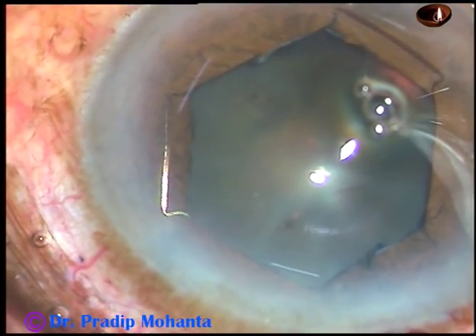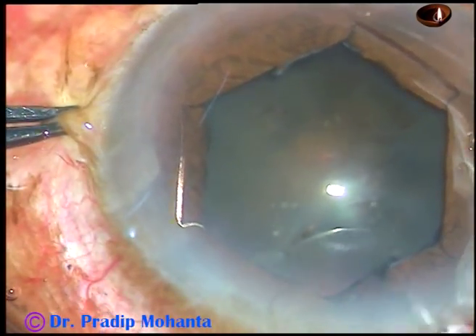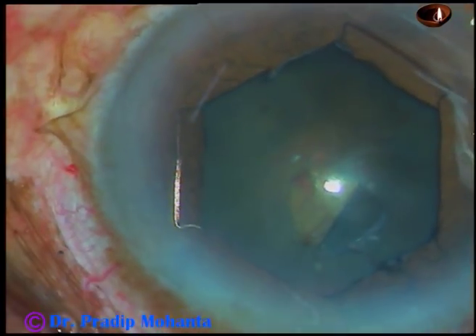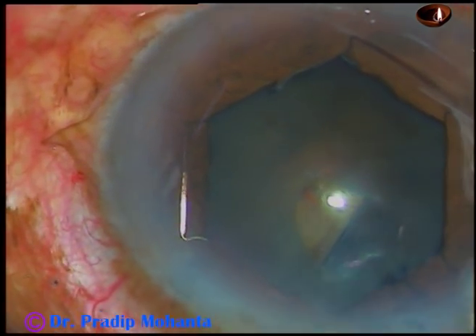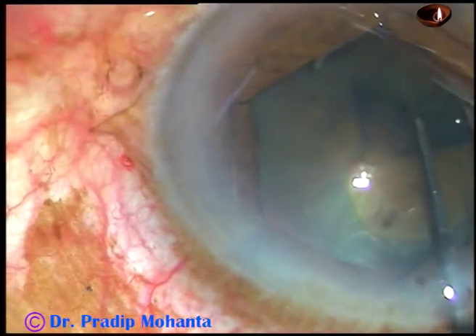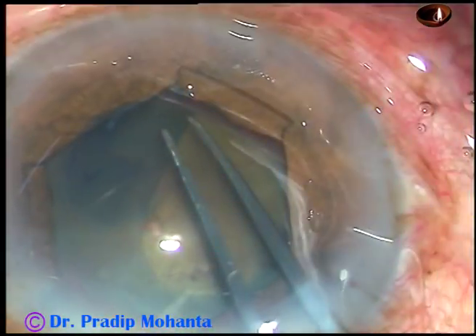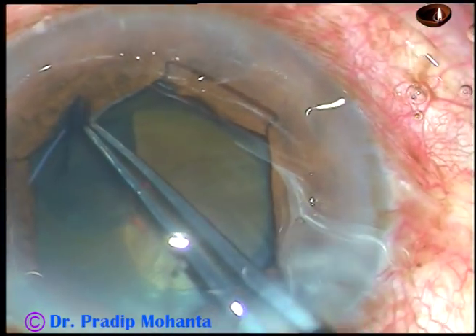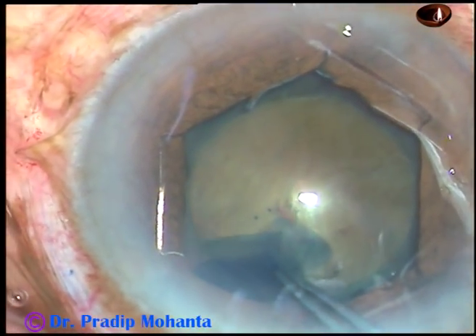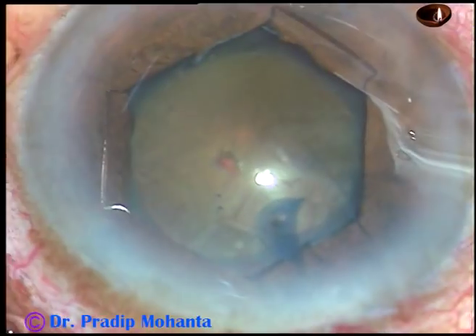We can see that the anterior capsule of the cataract is also nicely and uniformly stained because the trypan blue was injected behind the iris. Now the capsulorrhexis is being done. The anterior capsule has been incised with a 26-gauge bent needle. Now, with the help of the utrata forceps, the capsulorrhexis is being done. The rhexis is guided along the border of the dilated pupillary margin.